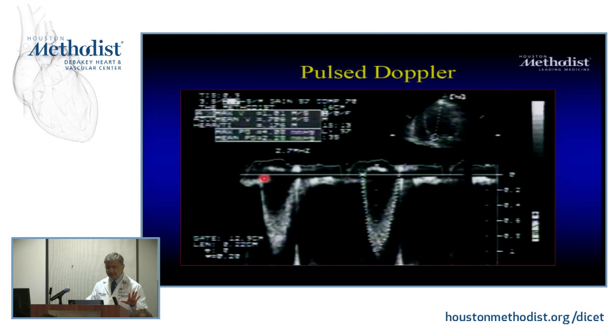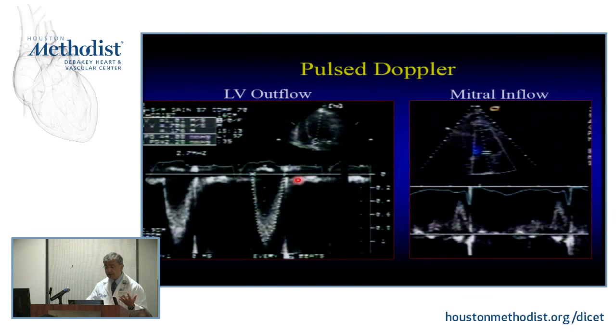So basically, in this pulse sample volume, I sent this packet, I listened after a while at that depth, and the frequency shift occurred more negative. This is 0, more negative. Here, all of them are together, so most of these red cells are aligned together. Once they start slowing down, some of them are going a little faster than others, and that's why you see spectral broadening. That's what it's called. And then deceleration. So that's pulse Doppler.